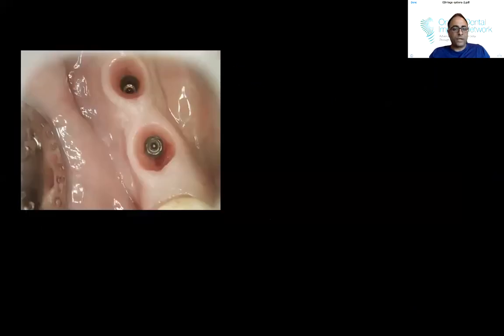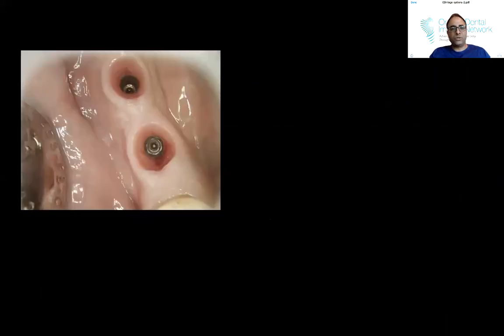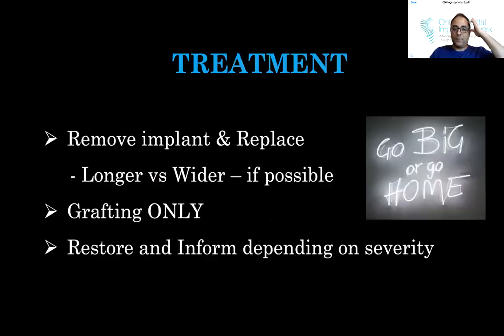But with this one, the guided surgery is quick and easy, and it puts your implants in really nice spots, especially when you're dealing with multiple implants or narrow spaces. You can see this case actually has it all, right? It's got molar sites, so we're able to do this one surgery, one step with some wide healing abutments. And then of course a lower anterior case, which is much more challenging. And again, you can do guided.